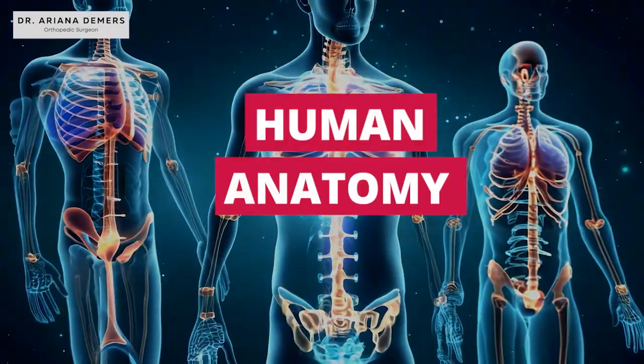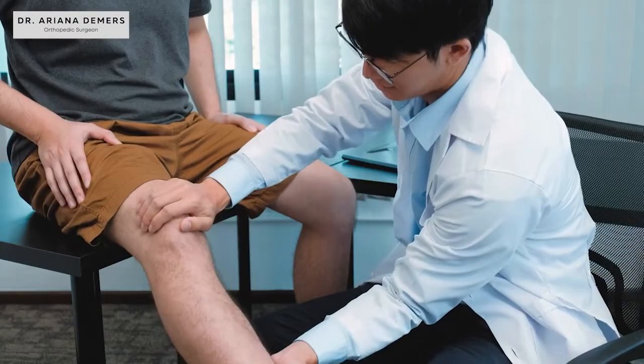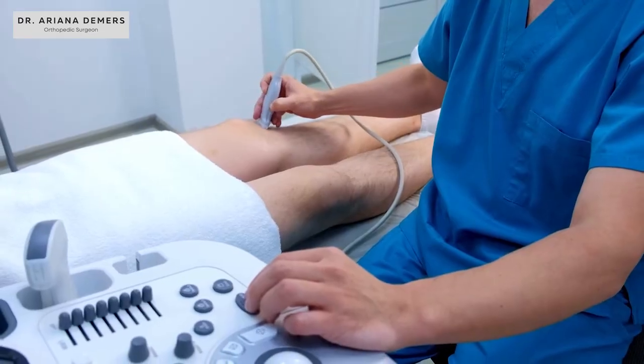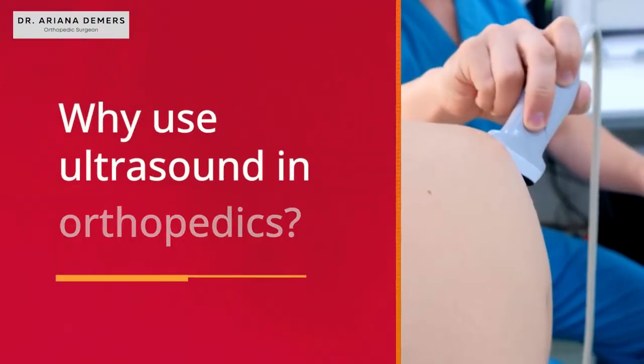Human anatomy is very variable, and it's always quite surprising to see what you think was one thing is another, and you can confirm for sure under ultrasound guidance. So why use ultrasound in orthopedics?